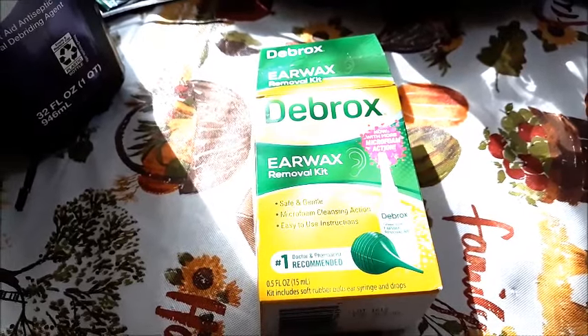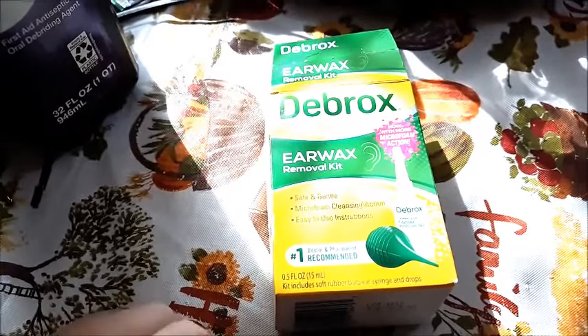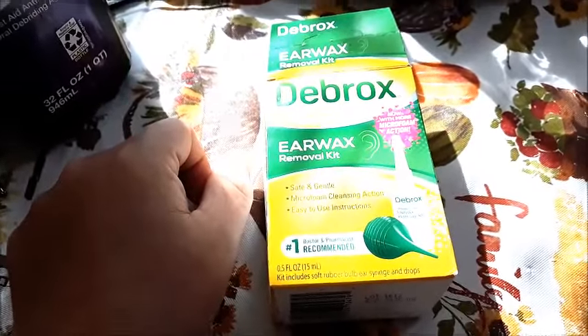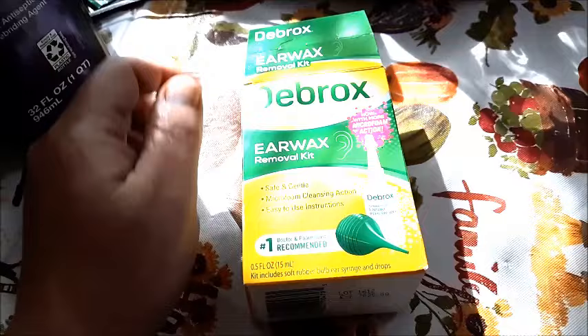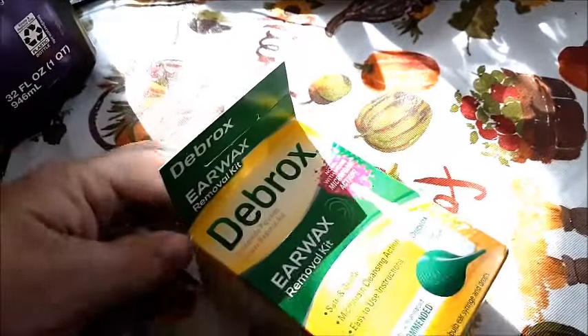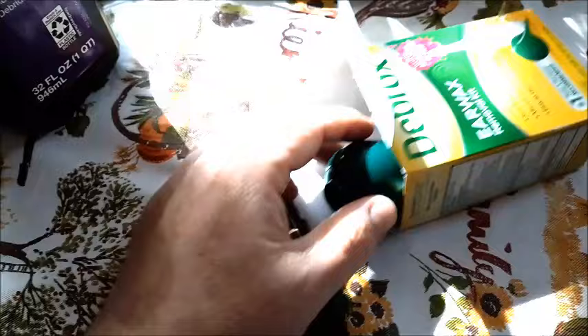Greetings! In this video, I'm going to show you how to use the Debrox earwax removal kit. It's fairly simple to do — basically you're using this to remove irritable earwax that accumulates in your ear over time. I want to demonstrate on my own ear how to do it here in a second.